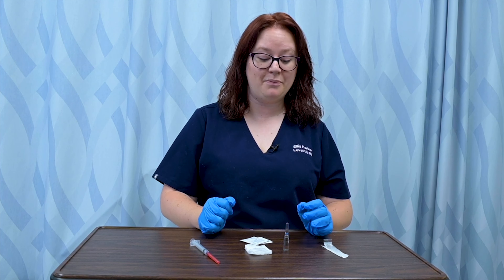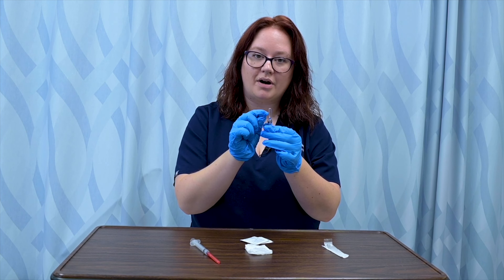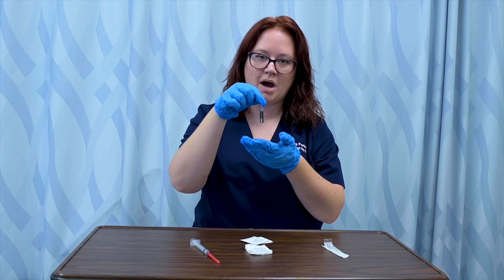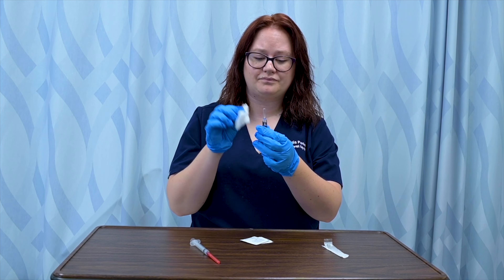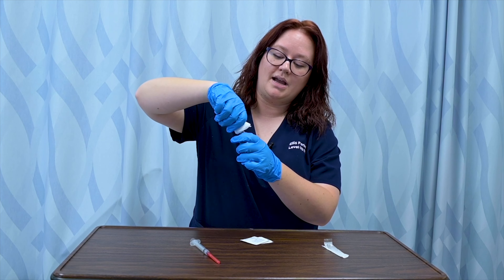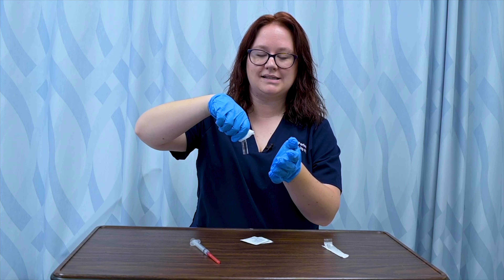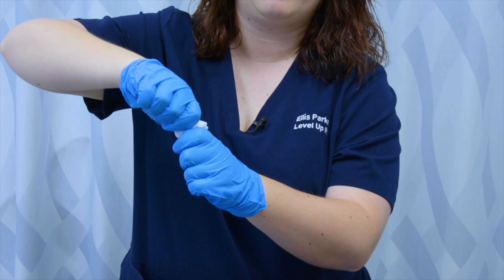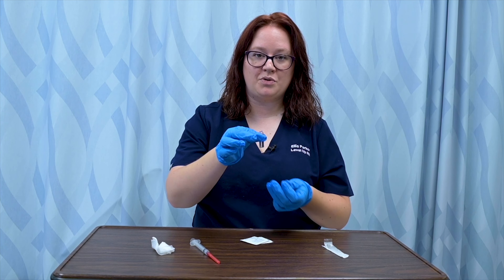To take medication out of an ampule, I'm going to get my ampule and tap the top part — called the neck — a few times to make sure all the medication is in the bottom part, or the body of the ampule. Once I've confirmed it's empty up top, I'm going to take a 2x2 piece of gauze, wrap the top of the ampule, and snap the neck off away from my body, just in case there are any glass particles. They would go out in front of me instead of towards my face. And now my ampule is open.